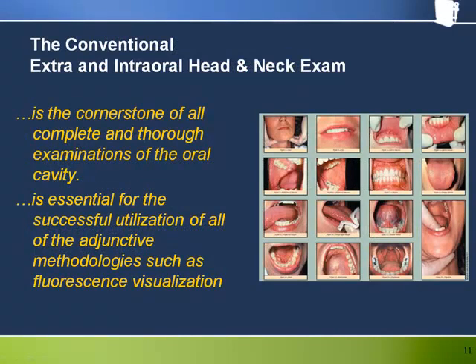A detailed discussion of the traditional extra and intraoral head and neck exam is beyond the scope of this presentation, although it is the central topic of another module in our online education series. However, we wouldn't want to go any further before reminding you of its crucial importance in a comprehensive oral assessment process. It is the cornerstone of all complete and thorough examinations of the oral cavity. Moreover, it is essential for the appropriate utilization of any adjunctive methodology, including VELscope. If you pick up the VELscope without first having conducted an examination under white light and palpation, you're doing it wrong.